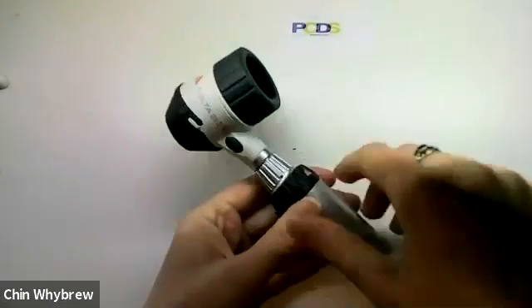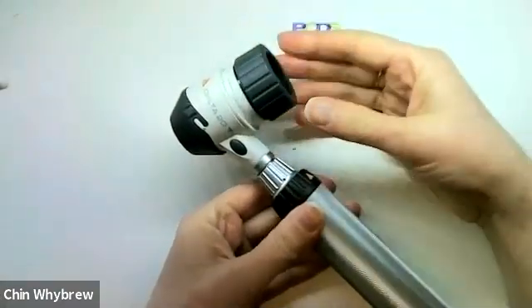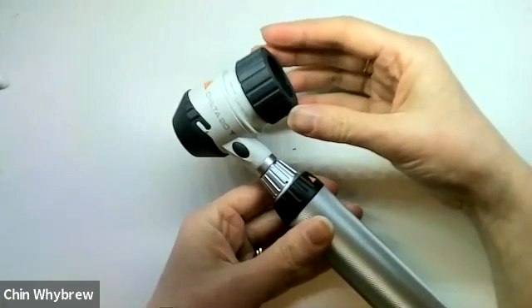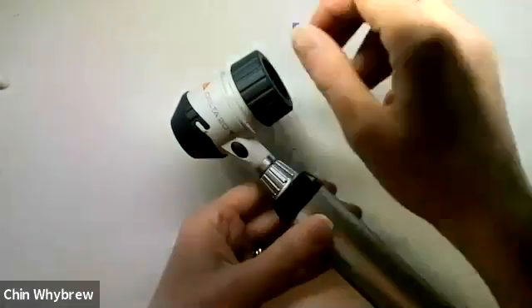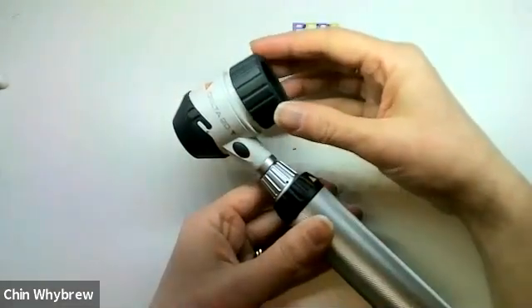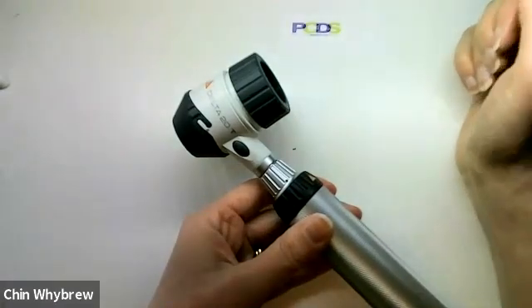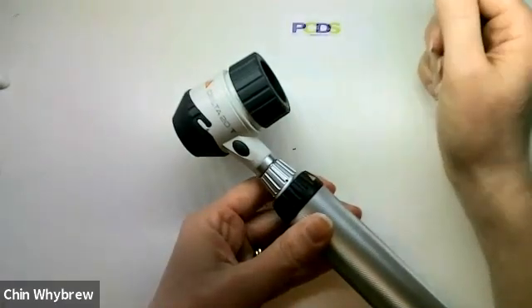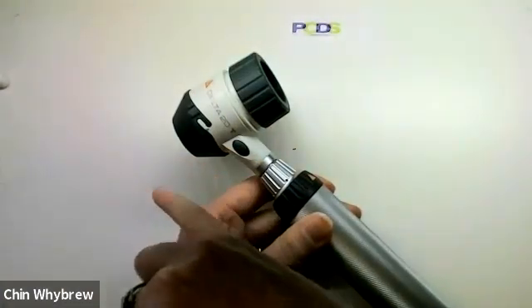In order to focus it, you twist this bit here. When you have it ready and want to attach a camera to take a picture, it has a marker here for where to position it so that it will be lined up perfectly for your camera to focus and take a picture through the dermatoscope, particularly for a flat lesion.